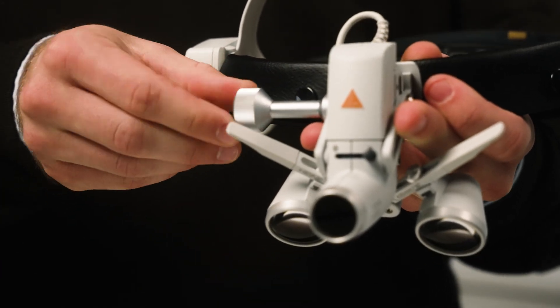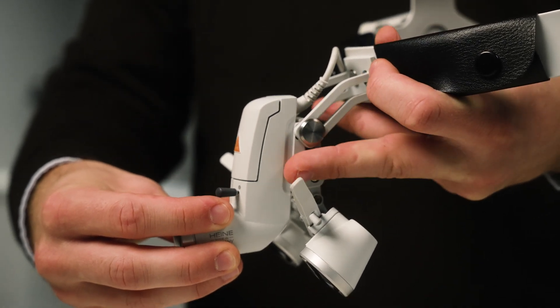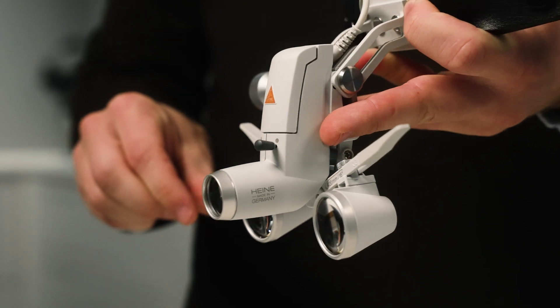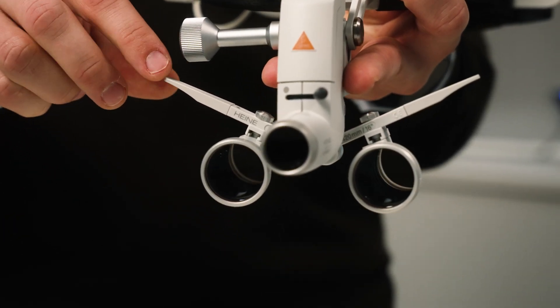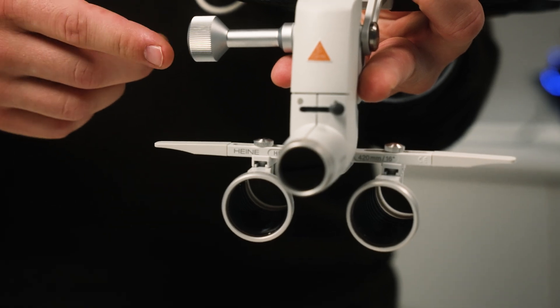Start by loosening the main fixation screw. Then align the unit of the individual loops and light source so that they point parallel to each other in the same direction. The carrier rail of the magnifying glasses must remain horizontal. Don't tighten the screw yet — we will do that later.